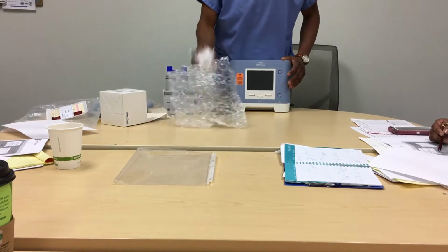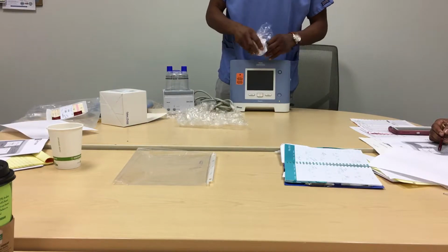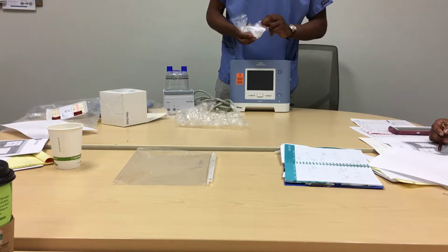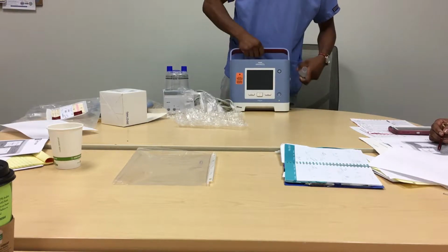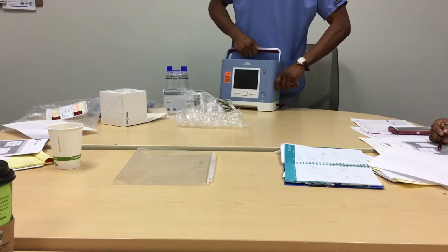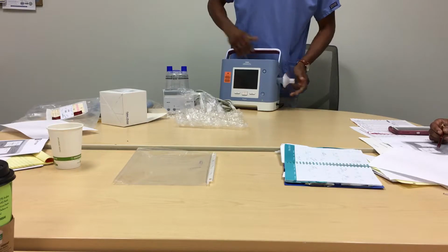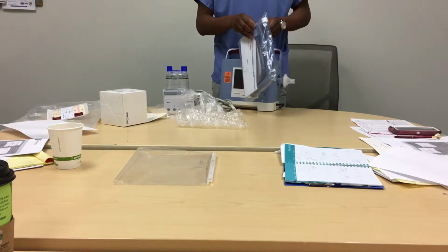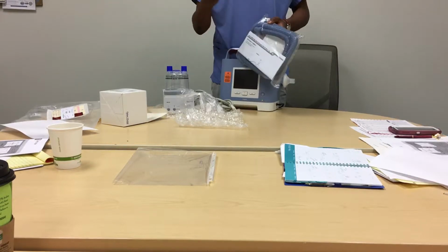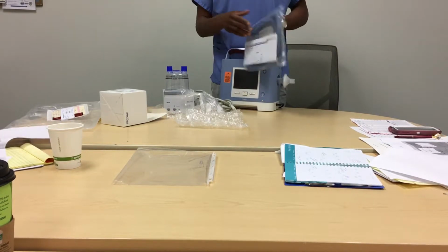During a setup, we always use a bacterial filter that will go into the side first, which I recommend they change every 1 to 2 weeks, depending on the usage.